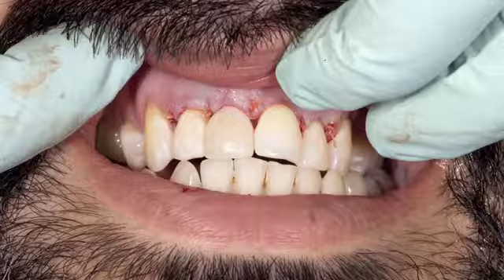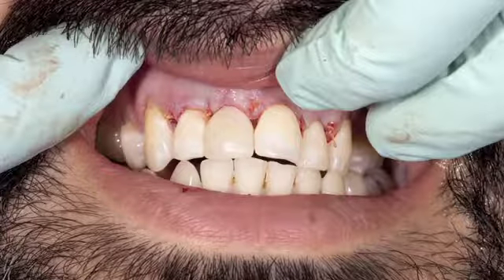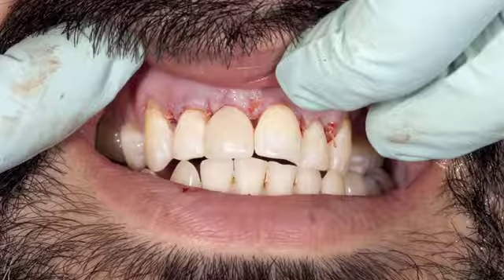As you can see, there is some blunting of the papilla as a consequence of the preoperative status, but the hope is that the soft tissue contouring of the custom temporary abutment will allow us to regrow some of the papilla in that area to achieve a better aesthetic result.